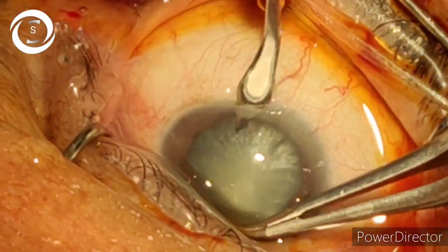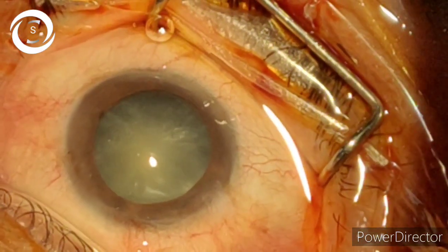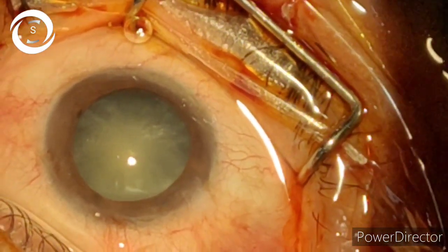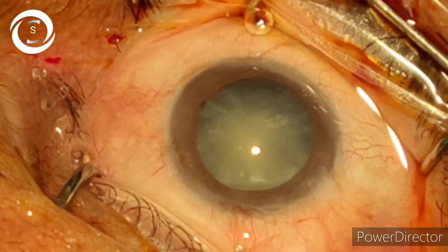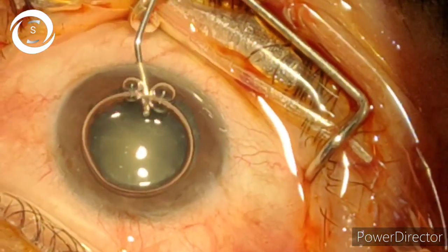Hi, I am Dr. Sharjee and you are watching my YouTube channel. Today I would like to show you yet another case of phacoemulsification. In this case I will show you my modified tilt, rotate and chop technique.